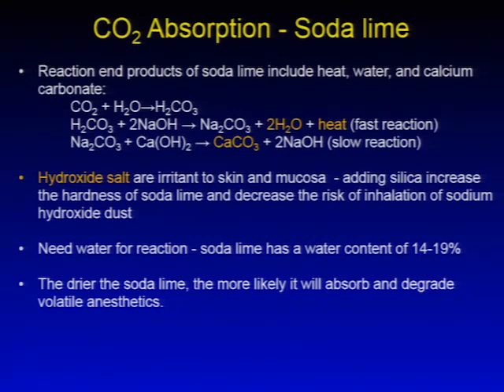The slow reaction creates the calcium carbonate. And then hydroxide salts are irritants to skin and mucosa. That's the reason you have to add silica to increase the hardness of the soda lime and decrease the risk of inhalation of sodium hydroxide dust. But still, the silica itself may be an irritant of the mucosa.